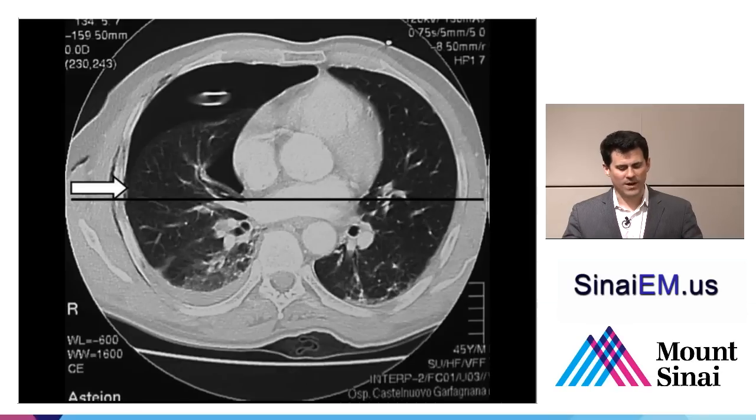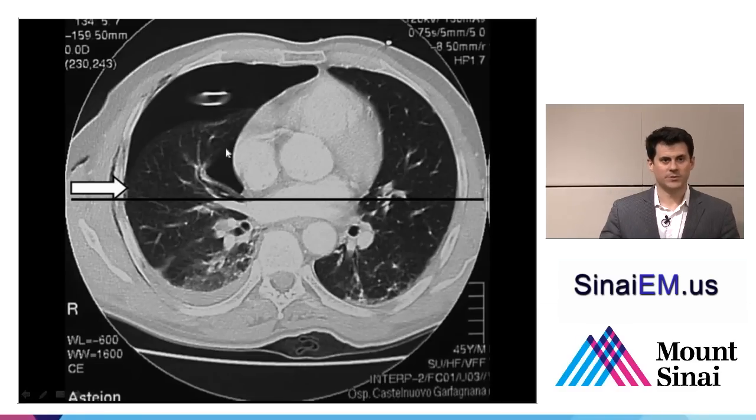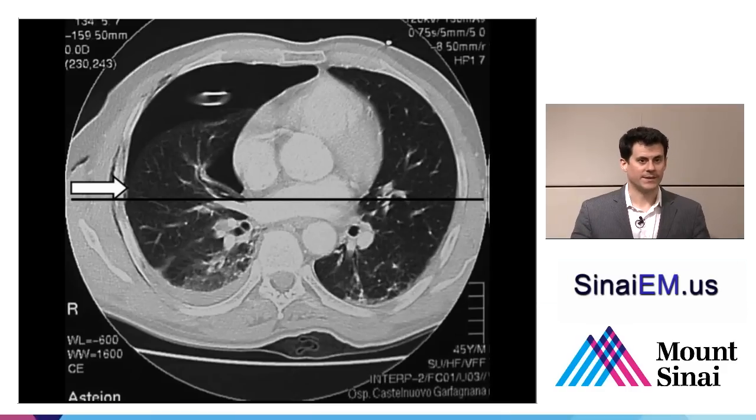And here's an example of why. We can see a CT scan here where there's not only a pneumothorax, there's actually a chest tube in place already, where you can see the chest tube here and highlighting the area all around the pneumothorax. But notice that, as this arrow demonstrates, the lung parenchyma is right up against the chest wall here, and lung parenchyma is right up against the chest wall there. So often when you do a portable projection anterior to posterior through a chest wall that looks like this, you don't really see a clean pneumothorax edge of lung parenchyma margin, which is what you would often look for when you look for pneumothorax on portable chest x-ray.